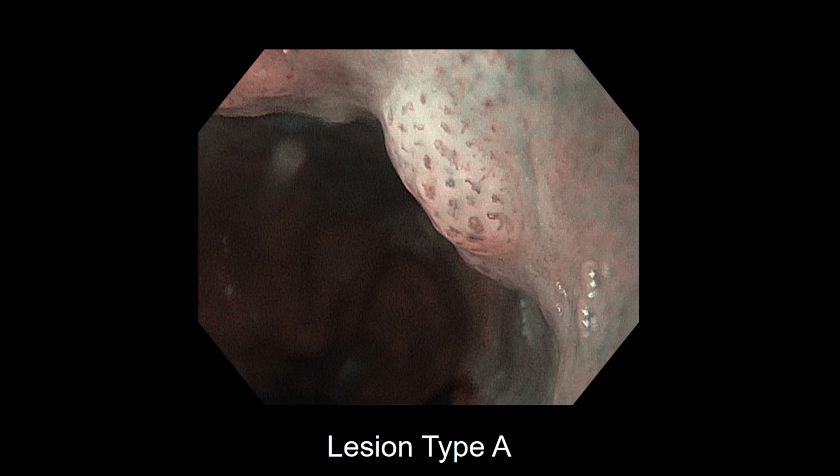As I mentioned, this esophagus had two different kinds of lesion. I call it here lesion type A. This lesion is more protruded, and here we see very nicely the IPCL. From my description, I would say these IPCL are more intense, but still I would suggest this is a mucosal lesion. What is your opinion?